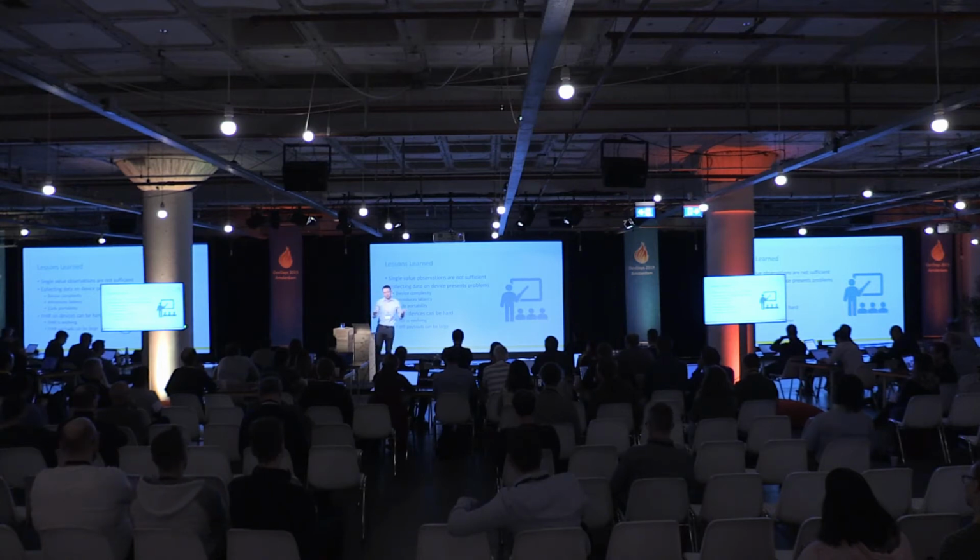There's also a problem around code portability. It's one thing if you write gateway code for a device that's sending data to the cloud, with a robust implementation that handles how you want to buffer the data, send it up, and maybe convert it to FHIR. But how are you going to make that portable across the whole suite of devices?